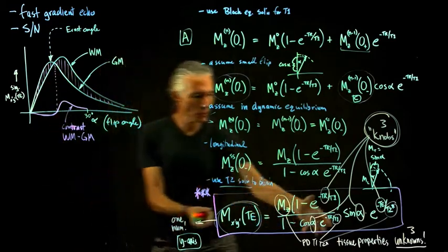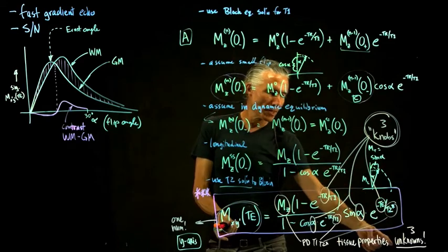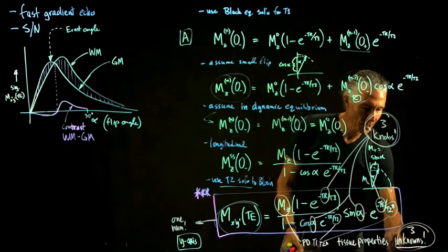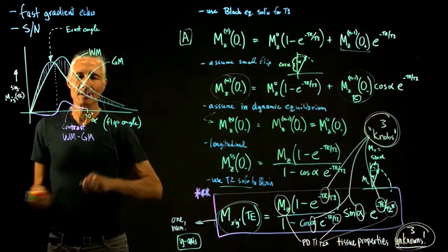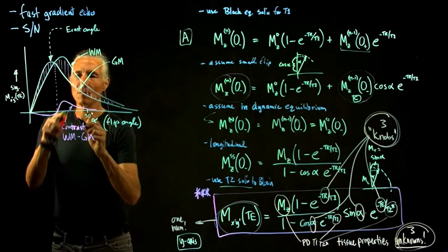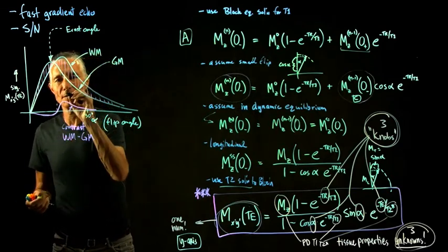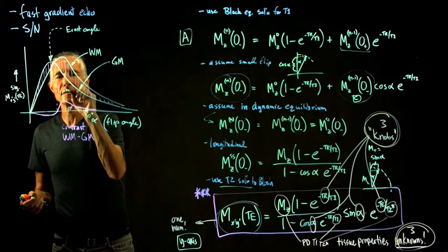So two sets of these equations with different settings for the tissue. And what we want to know is what is the maximum of that difference? And so here's what we really want, this point. Where is the most contrast? So max contrast.